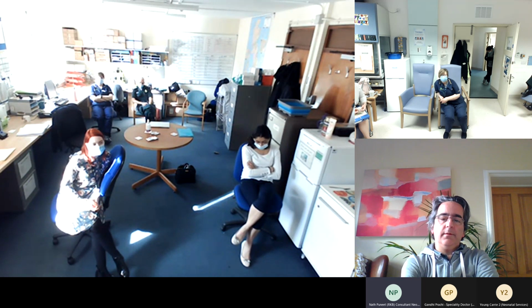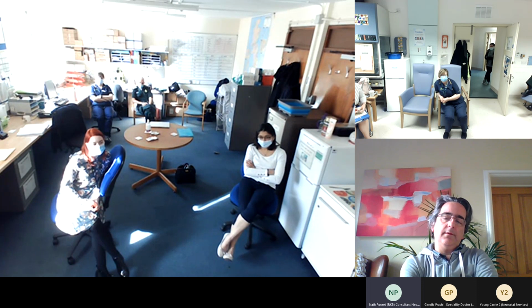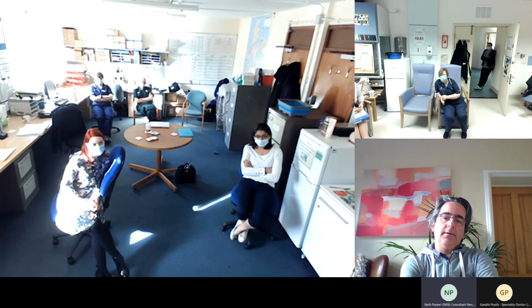A couple of centimeters short for UVCs for 1 hour, 2 hours, depending on the baby's condition, won't make a huge difference and should be handed over then to the receiving unit for the appropriate line positions. But the key thing is to be absolutely happy that those lines are there where they should be, and if not, then remove them and use peripheral access. And it all depends on the baby. You can't have just one rule for all kinds of babies.